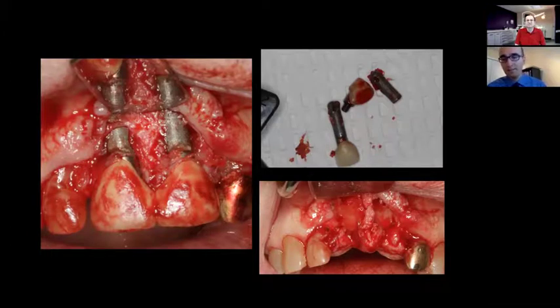This area is extremely important to be taken care of surgically because the bone is very thin. The premaxilla is very fragile, and you want to minimize any forces. So it took me about 45 to 50 minutes to remove these two implant fixtures because they were osseointegrated from the palatal, mesial, and distal aspects. So you have to go and make a trough with your piezoelectric surgery.